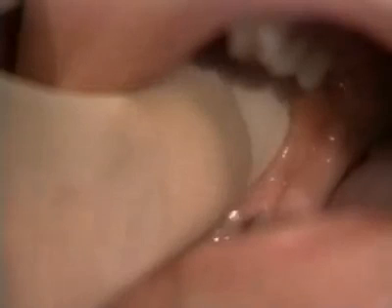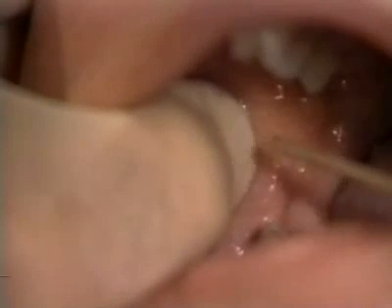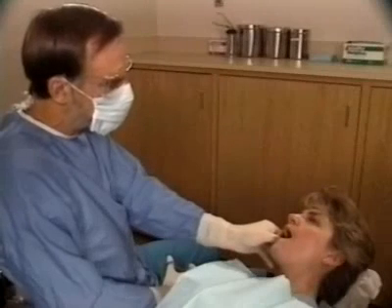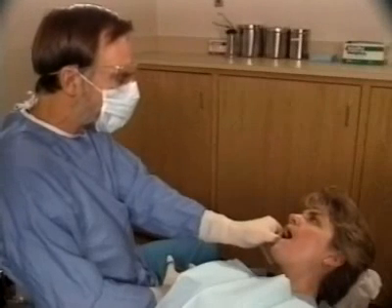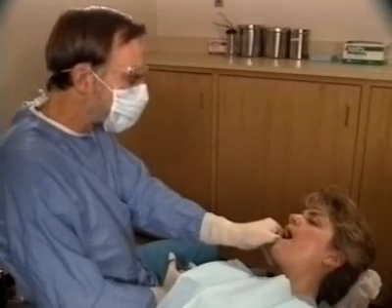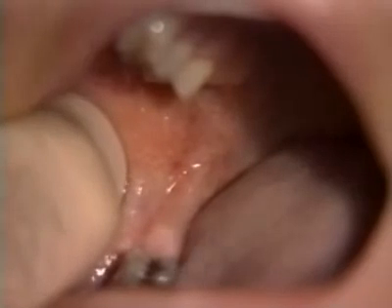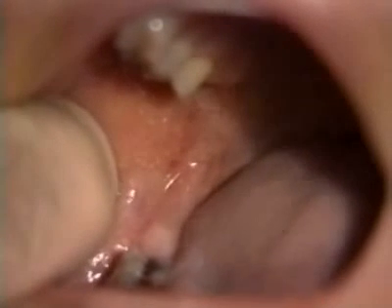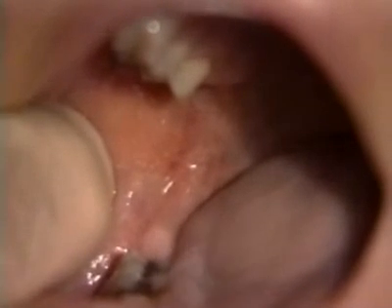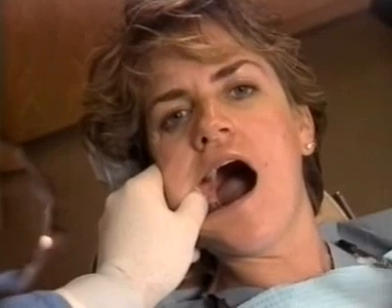The lateral border of the space can be determined by palpating the deep tendon of the temporalis muscle on the temporal crest of the ramus. The insertion must be made medial to this landmark. With the patient's mouth wide open, the thumb is placed over the anterior border of the ramus and pulled laterally, retracting the cheek and the buccal fat pad until it rests within the greatest depression of the coronoid notch and is made parallel to the mandibular occlusal plane.